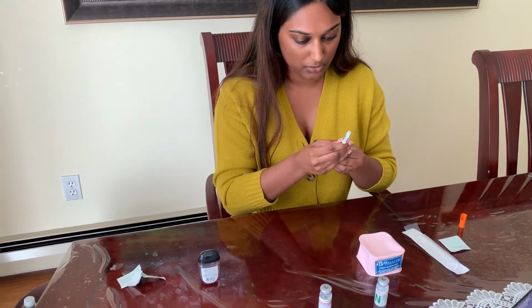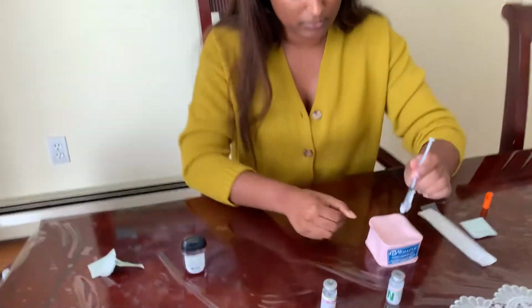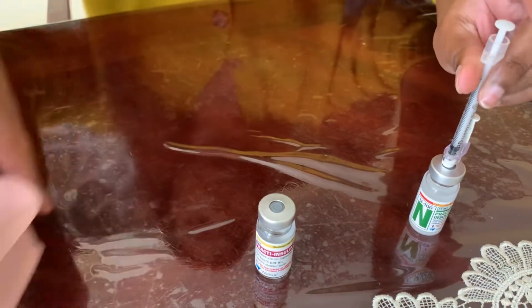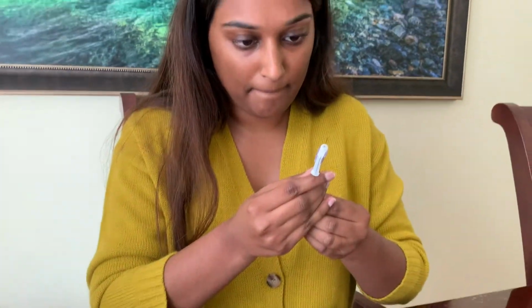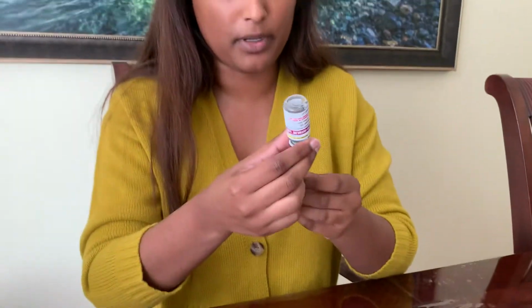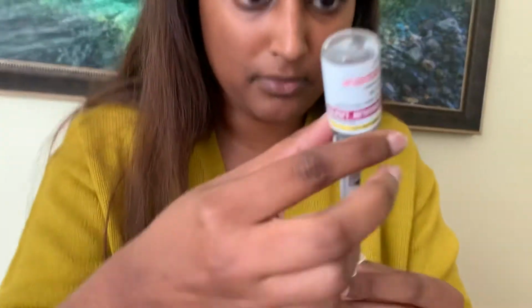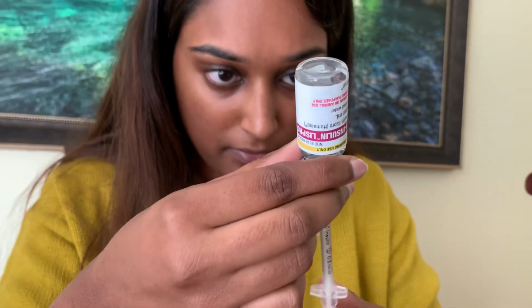So 22 units of air. Just going to move that to the side actually. Okay, that's 22. I'm making sure I put 4 in this, and then I'm going to flip it upside down and pull back 4 units. Just getting rid of any air bubbles.